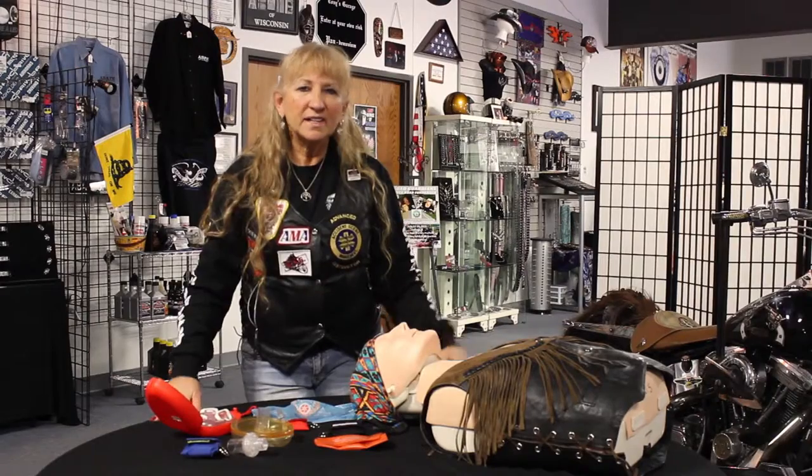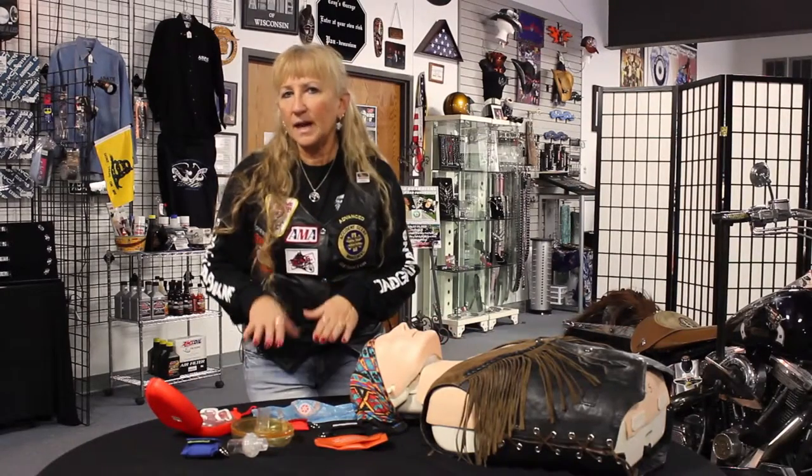Hi, this is Spitfire, and I'm here today to talk to you about some of the different kinds of rescue breathing barriers that may be out there, and somebody may bring to you if you were to do rescue breathing and ask you to use this device.